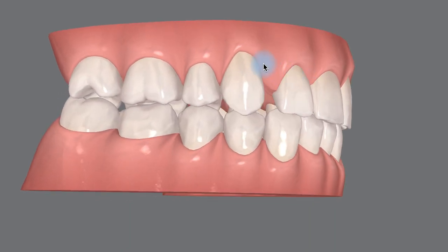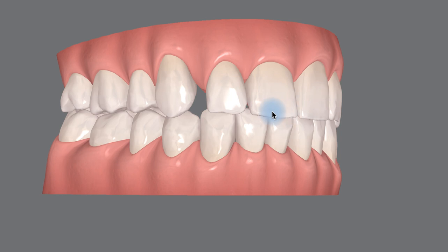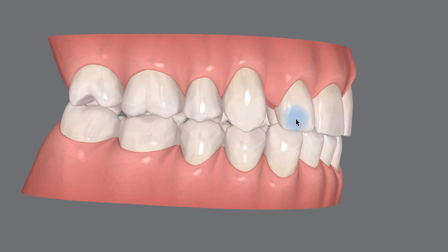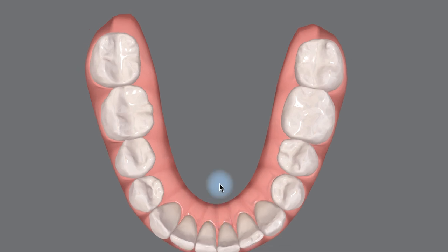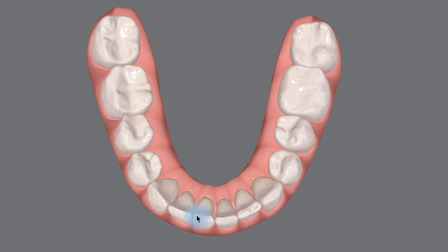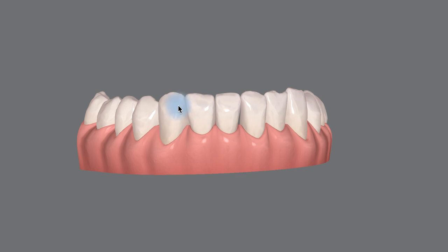This was Invisalign's first proposal, that we need to leave space somewhere in order to get this overjet. There are alternatives. We could do some slenderizing of the teeth on the lower arch, but my concern is I don't want to retract any of your teeth because you have sleep apnea. Maybe this will make more sense. I don't want to bring these teeth back this way. So one method to solve this problem is to do what's called IPR, where we reduce the tooth structure between the lower teeth in order to increase the overjet. That can work in some patients, but it's contraindicated for a patient who has sleep apnea. So we're not going to get our space by reducing on the lower.